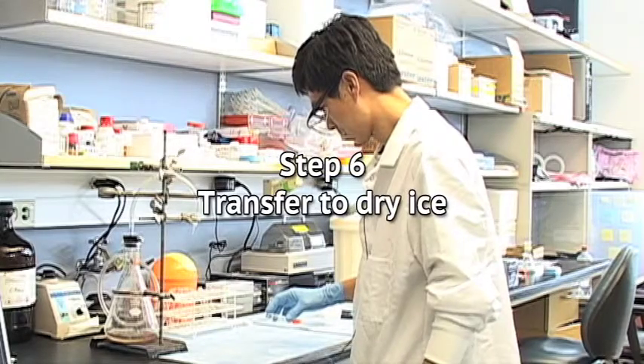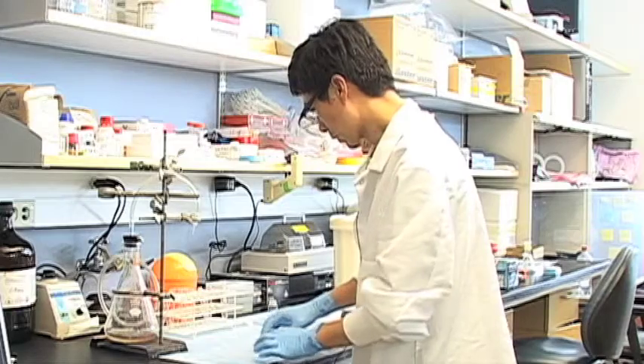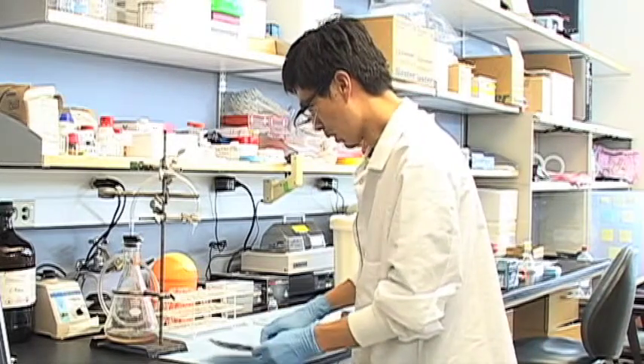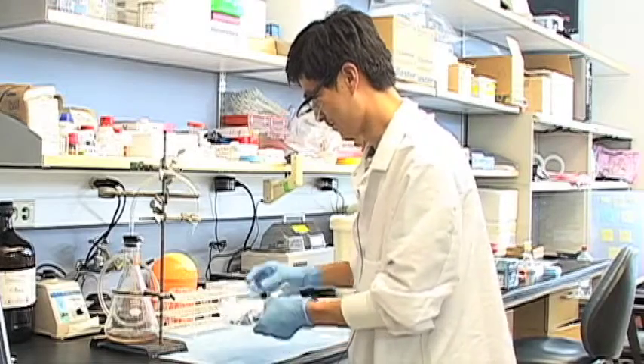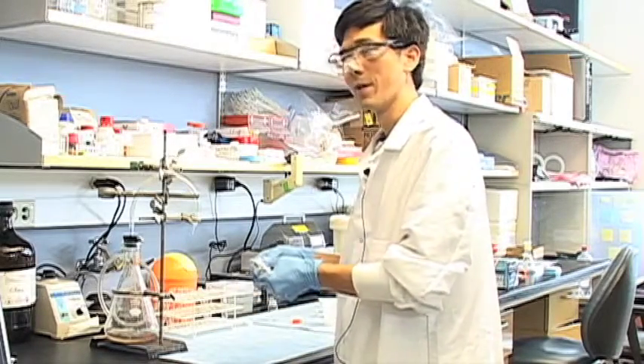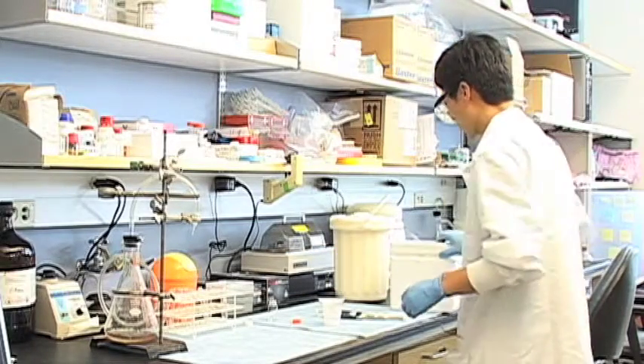Step 6: Transfer to dry ice. Watch for the most vigorous bubbling to stop, but some liquid nitrogen to remain at the bottom of the plate. At this point, transfer the plate to the cooler with dry ice. Once this procedure has been completed with all plates, they should be covered, wrapped in aluminum foil, labeled, and stored at minus 80 degrees centigrade.